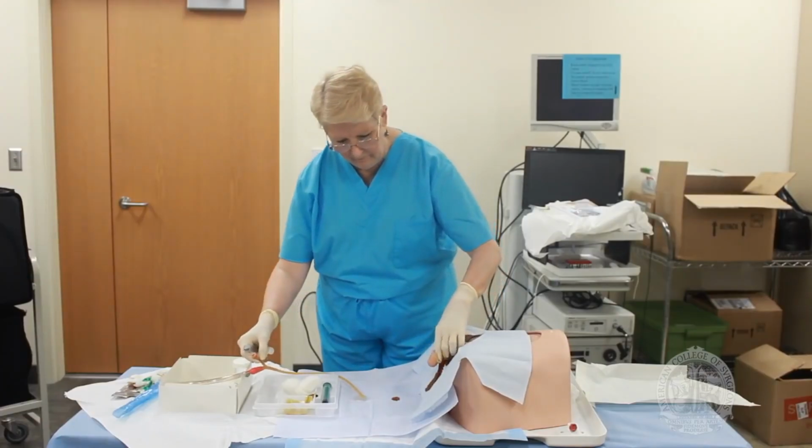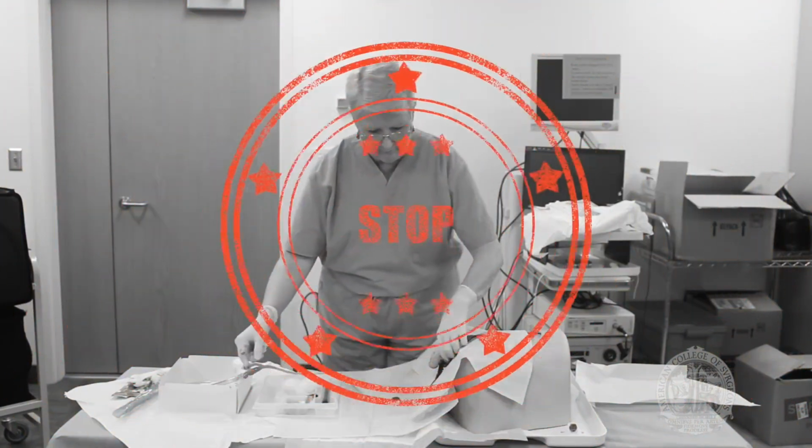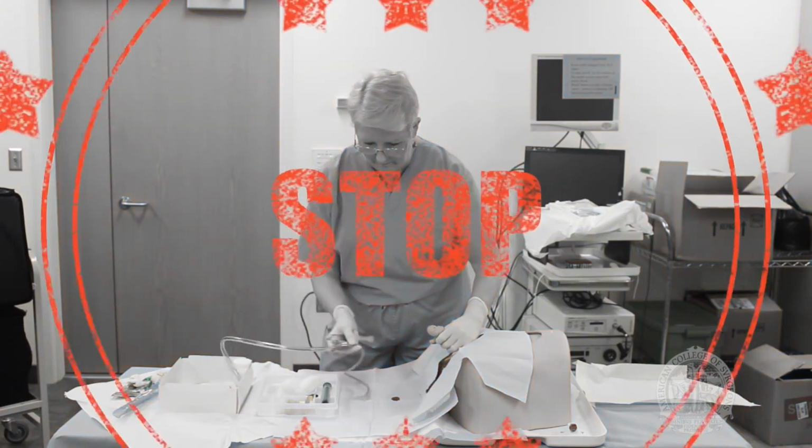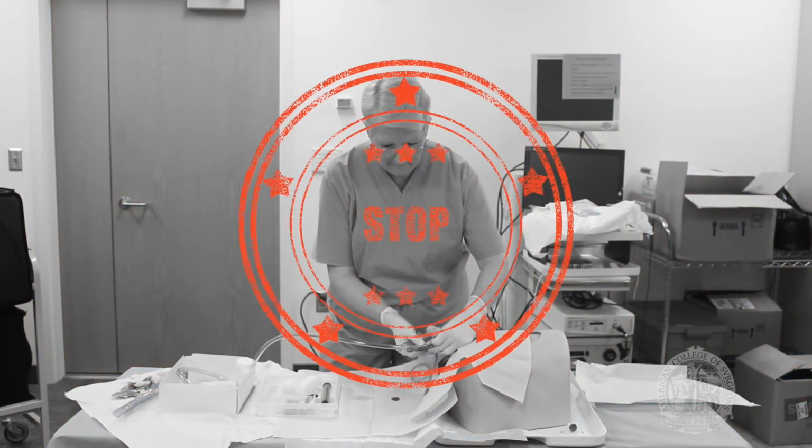Let's talk about errors and complications. By far the most common error is a break in sterile technique. Once your non-dominant hand touches the skin, it's contaminated and cannot touch any of the tubing or the catheter. Likewise, your dominant hand must stay sterile and not touch the penis or vulva or outside the sterile field.